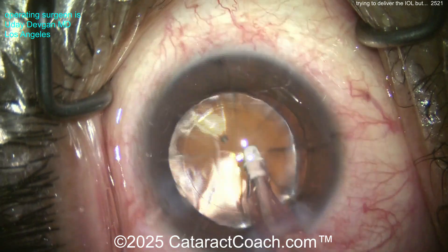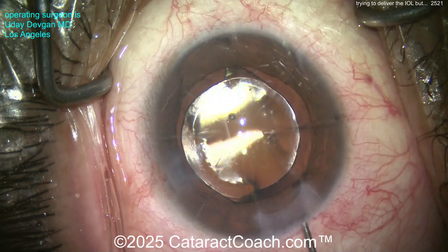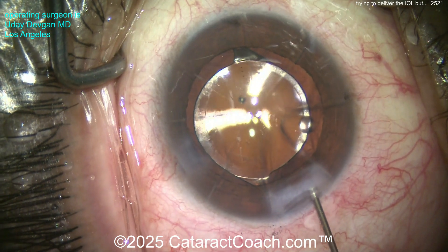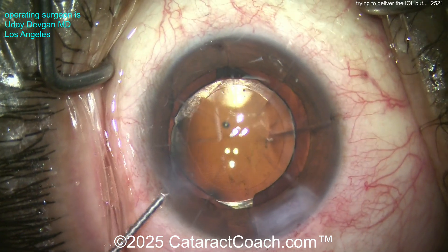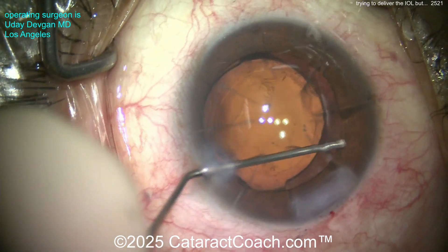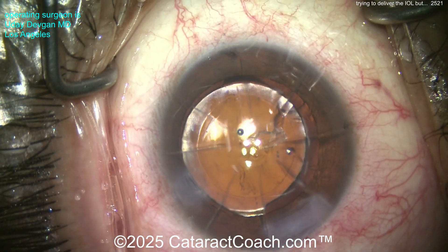In a case like this, why not spend an extra minute and check all the RK cuts? We'll seal up the incision here with a little hydration — but look, just hydrate the roof, don't hydrate the sides of the incision, because that's where the RK cuts are. You can rip the RK cuts right open just with your hydration. I promise you don't want to do that.